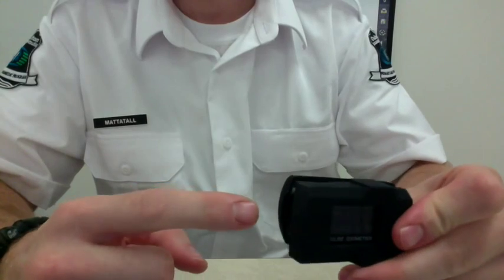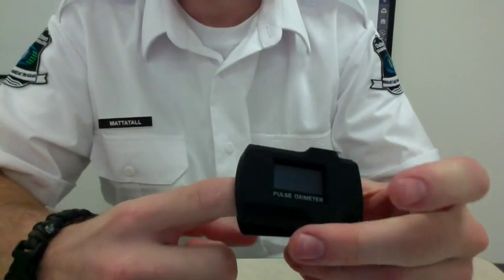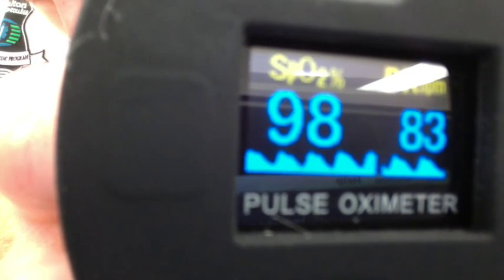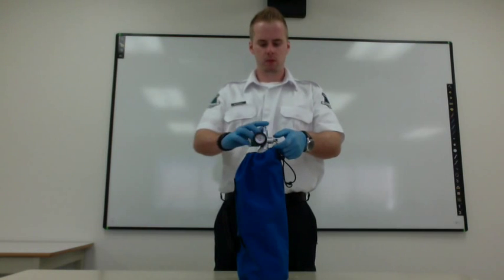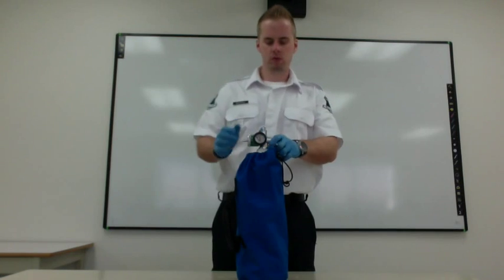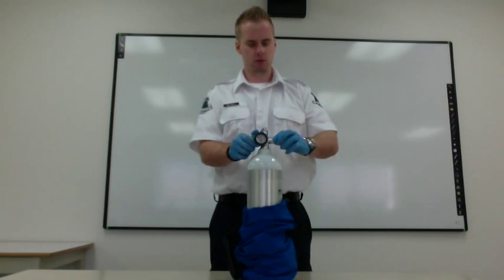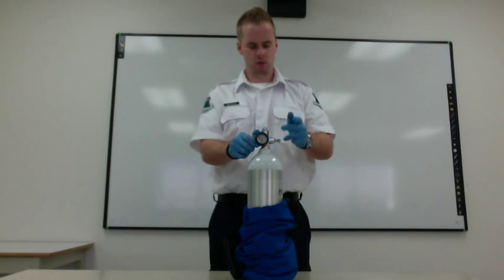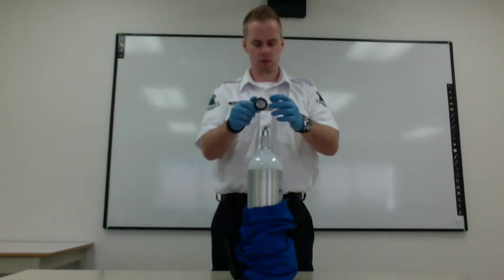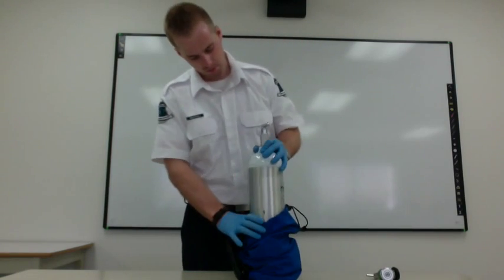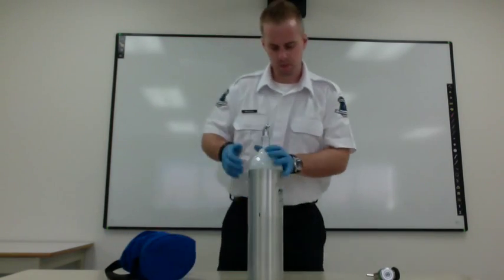To assess saturation, attach the sat probe to a finger. Then observe saturation and interpret the results. Turn off the regulator and remove it from the oxygen tank. Properly store your used cylinder.